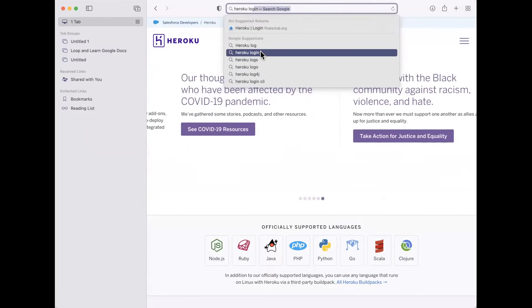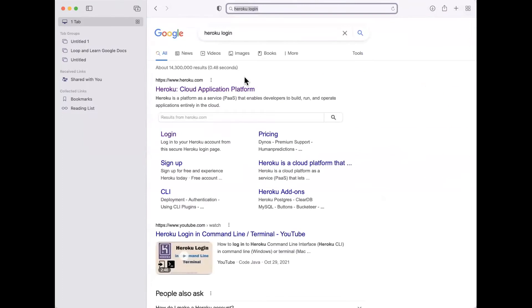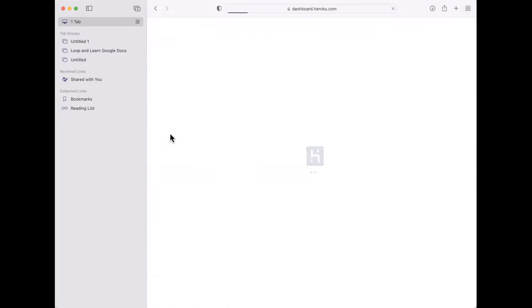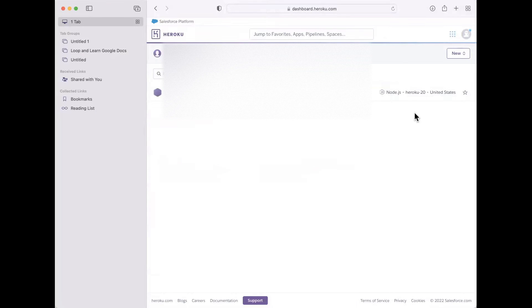First, I'm going to the Heroku login screen. I am now logged into my Heroku account.